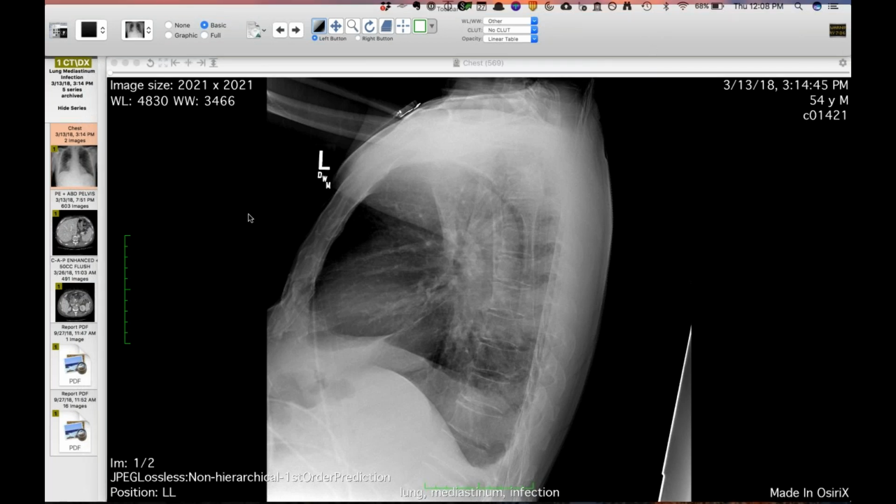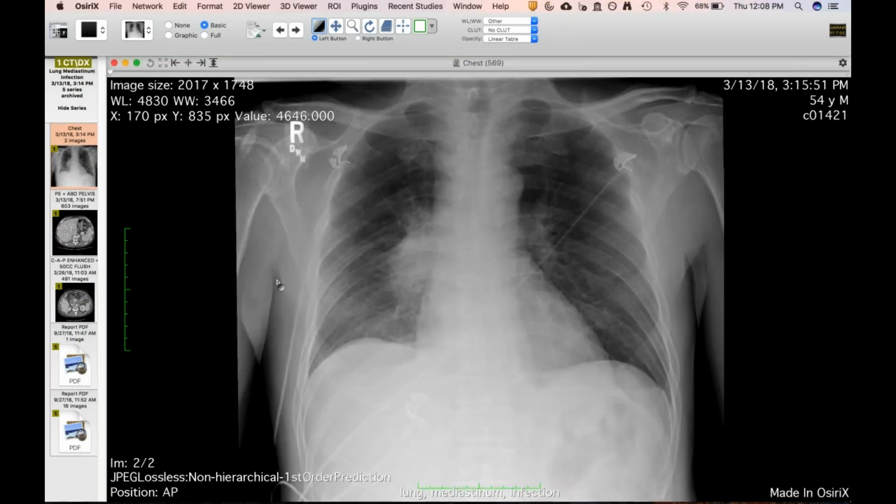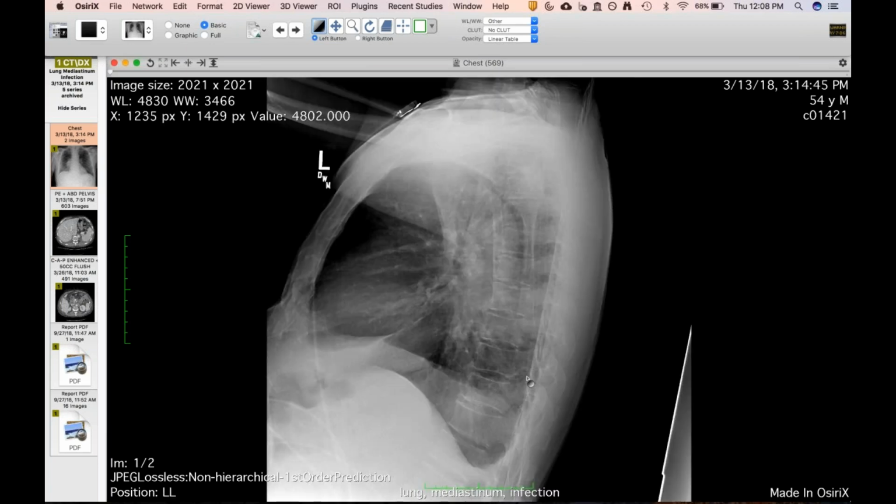Yeah, he did. So this is my bizarre infection case for the year. And this is another, just kind of a theme of patients that look like they could have cancer but don't. This is a 54-year-old man who came in, and on the radiograph you can see there's volume loss on the right side. There's a big, what looks like an infrahilar mass, and probably a small effusion on that side as well. You can see a small left effusion.